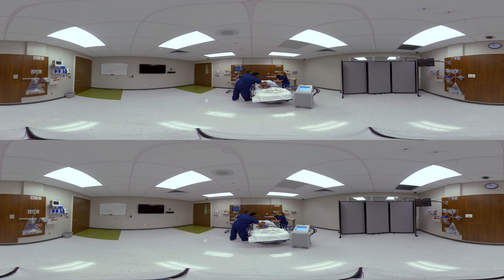Next, we're going to log roll him to the side towards you and we'll place another pad on his back.